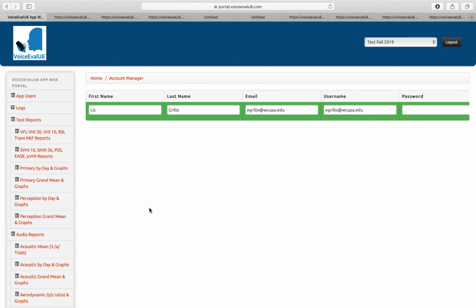So you can do this through telepractice. You can train the client to use it through a video conferencing session, and then they go about their day and they can use the app for the next 5 days in the morning and in the evening. So it is really relevant now in the current status of kind of where we are with the pandemic. And so VoiceEvalU8 has a lot to offer.